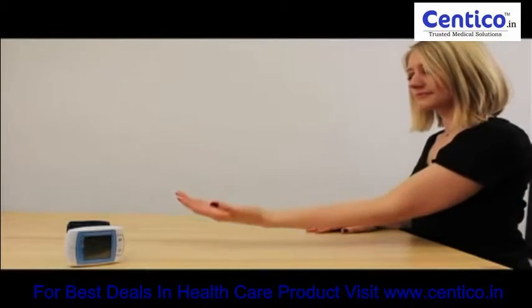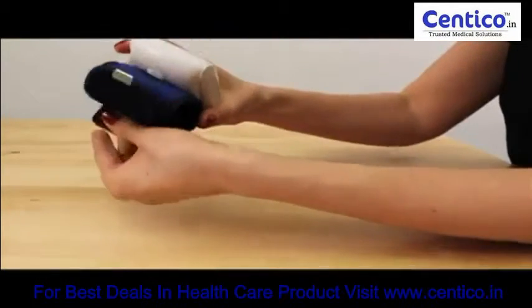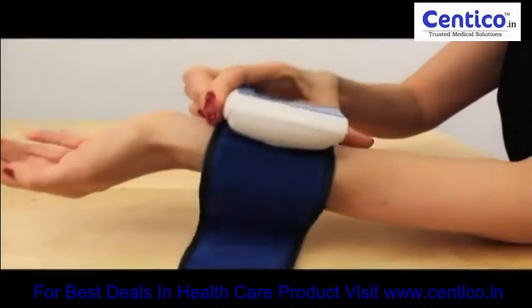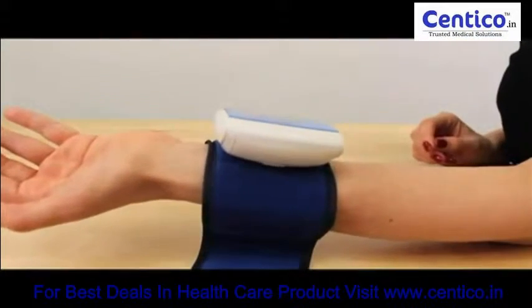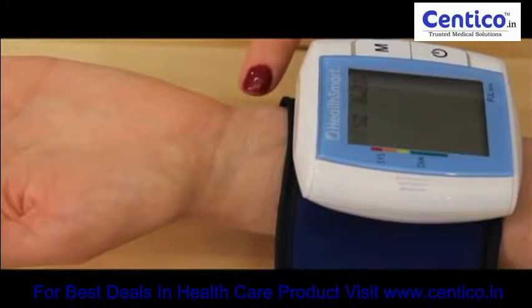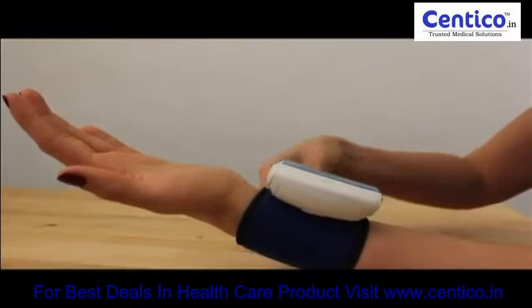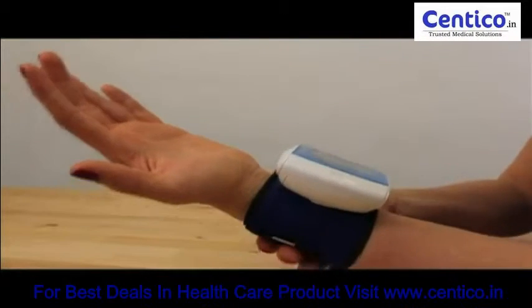Hold your left arm in front of you with the palm facing upward. Apply the pre-formed cuff to your left wrist. The digital panel should be on the inside of your wrist. The cuff's top edge should be approximately a quarter inch to a half inch from the bend in your wrist. Wrap and fasten the cuff securely, yet comfortably, around your wrist.